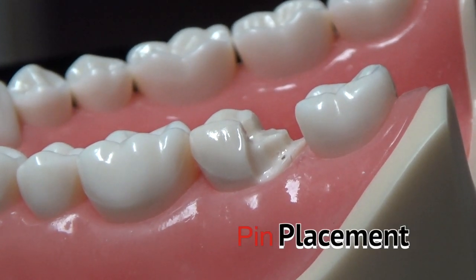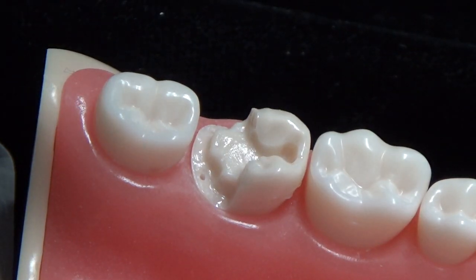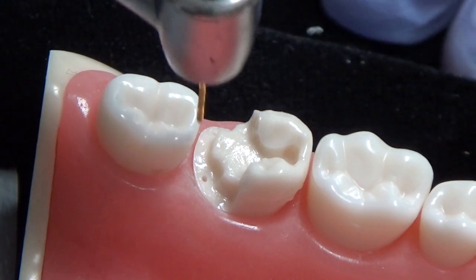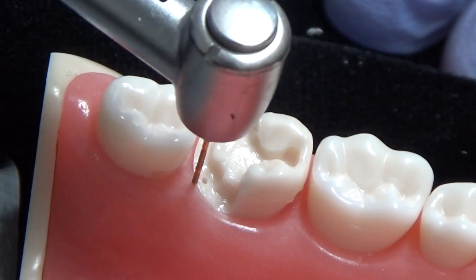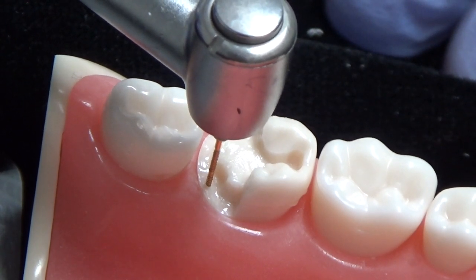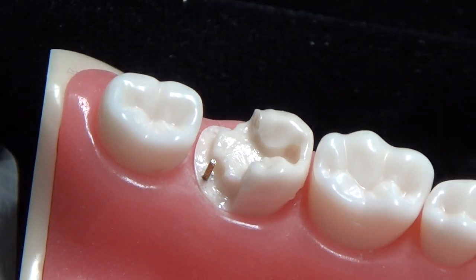Now I'm ready for pin placement. We're going to place the two pins, so we need to have the proper speed. I'll look at the lingual side, check the point of entry, verify the path of draw one more time, then press down firmly — the pin will fracture and is set. We'll repeat the same thing on the distal buccal.